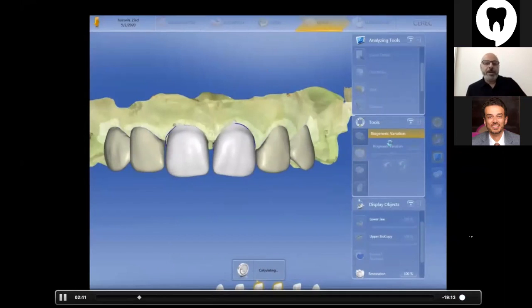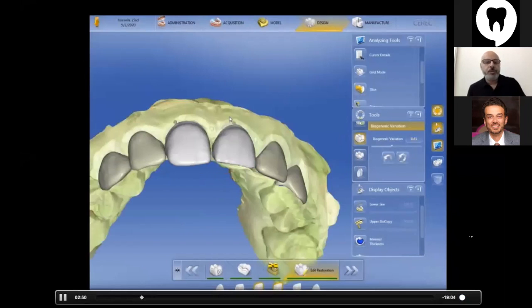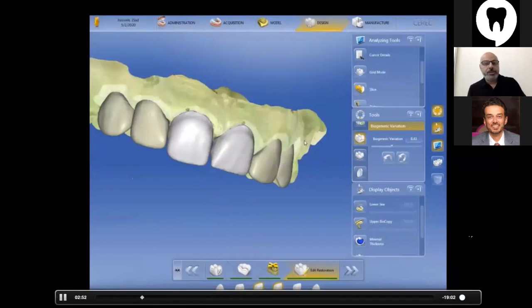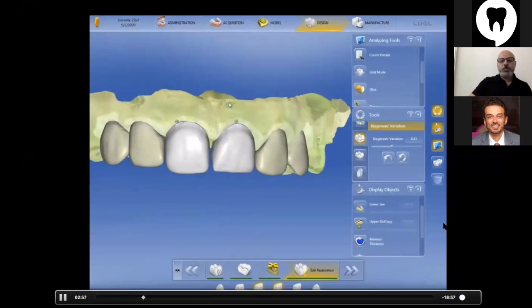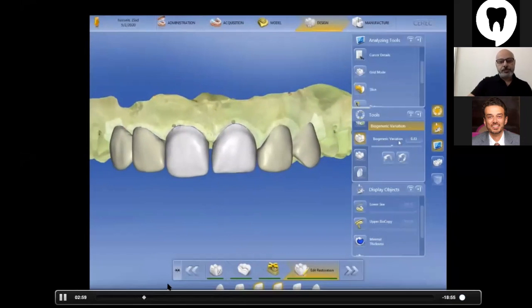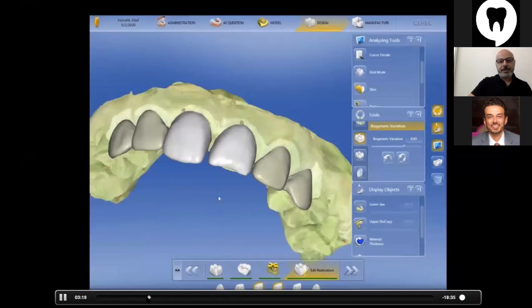This is one biogenetic variation. You can see here the anatomy is more exaggerated than the original design. You can work with it, choose whatever you like, and then adjust them later on. So this is the variation we chose. Actually, this one.